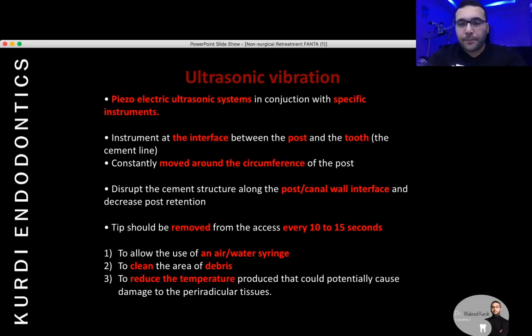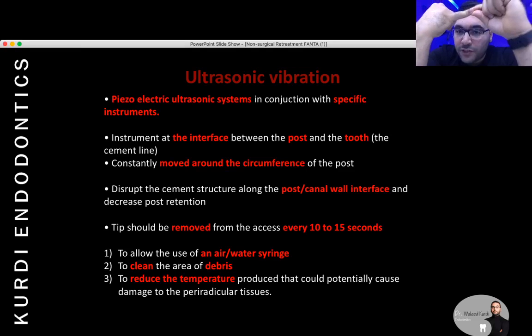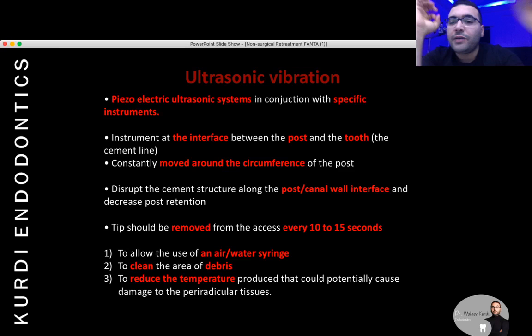And I have to tell you one very important tip. You should remove your ultrasonic tip in 10 to 15 seconds. If you are activating the ultrasonic for 10 or 15 seconds, remove it again. And this is very important. Why? To allow the use of an air-water syringe to cool down the whole system, to clean the area from the debris and to reduce the temperature.